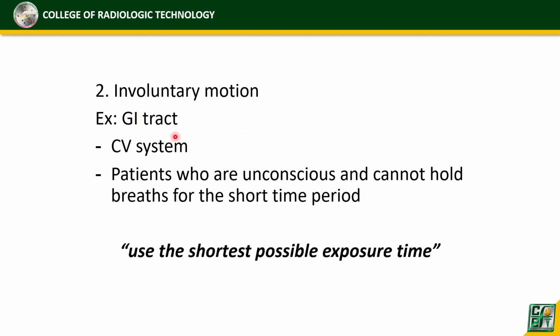tinatawag natin na peristalsis or peristaltic movement. Okay, the cardiovascular system, particularly the heart. Okay, then or patients who are unconscious and cannot hold breaths for short periods of time. Okay? So ano yung magiging solution for the involuntary motion? So the best solution is use the shortest possible exposure time. Okay? Ang dinidecrease natin ay exposure time.